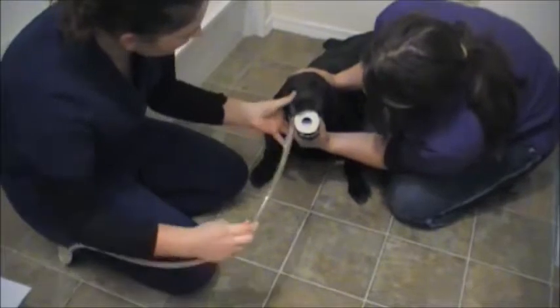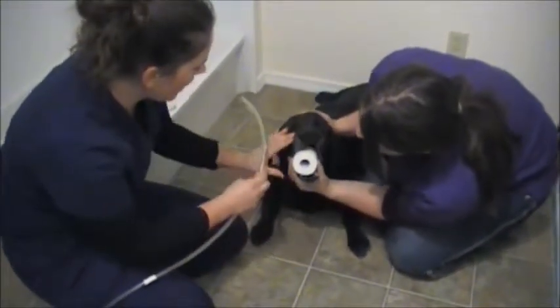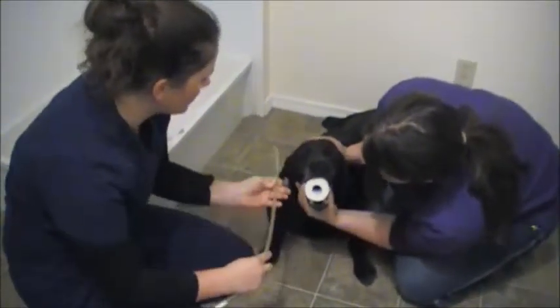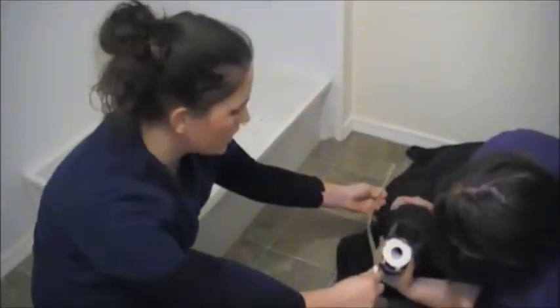And then I'm going to lubricate the end of the tube. Okay, so at this point I would take the tube and pass it through the center of the roll, and then just gently work it back down into the stomach. Right about here, I'd wait for her to swallow, passing it down through the throat until we get to where we have the tube marked here.